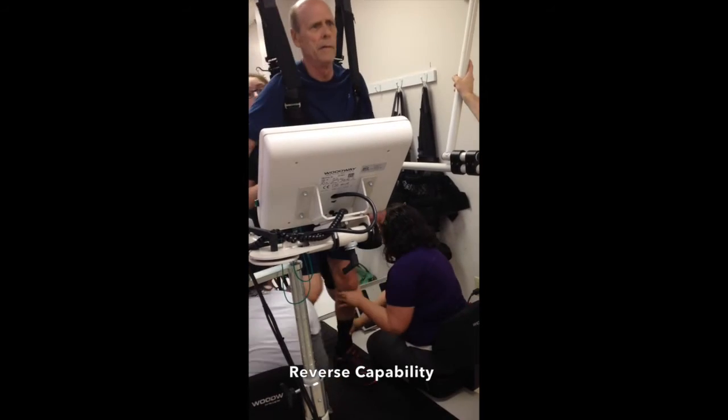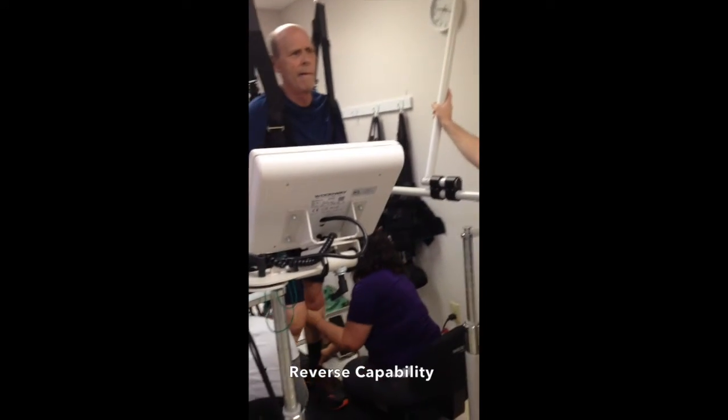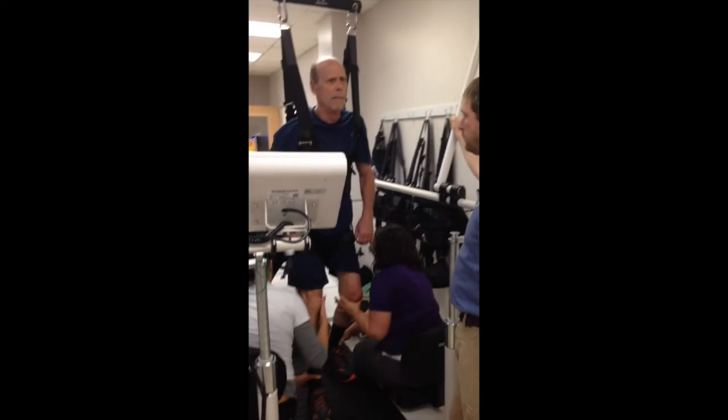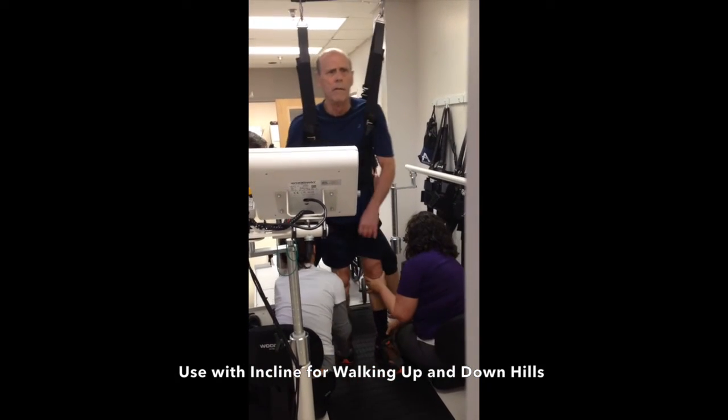Because the belt can reverse, the patient can practice stepping backward. In conjunction with inclining the treadmill, this allows them to walk uphill and downhill.